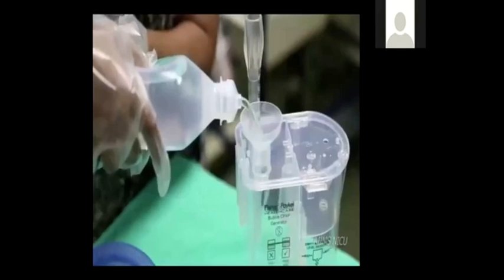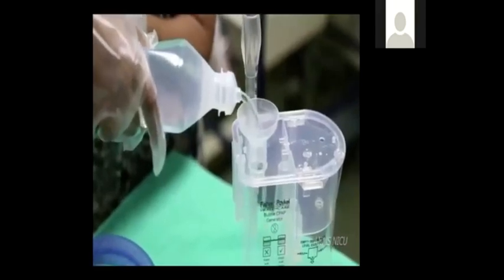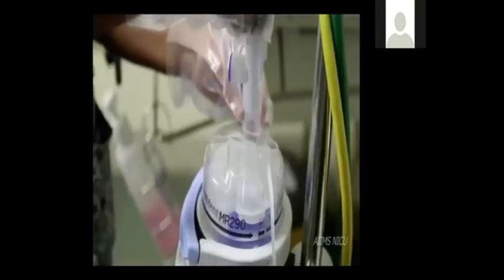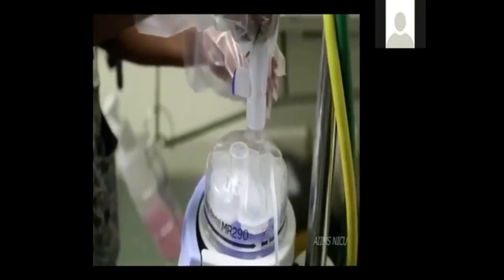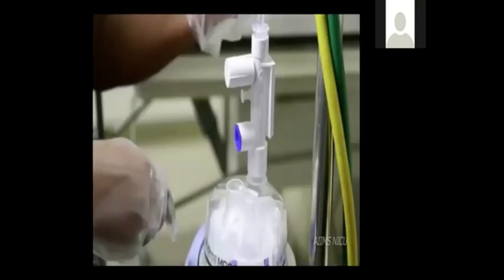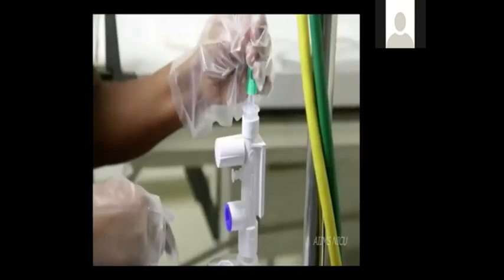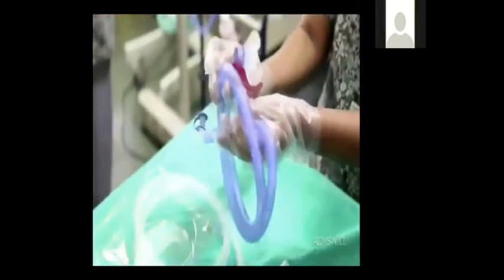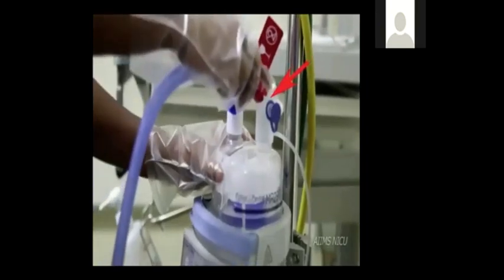Fill the bubble chamber with clean or distilled water and fix it to a slot available on the CPAP machine stand. Now fit the safety device between the flow meter and the water chamber of humidifier using the green gas tubing. Now connect the blue inspiratory limb to the other port of the water chamber.